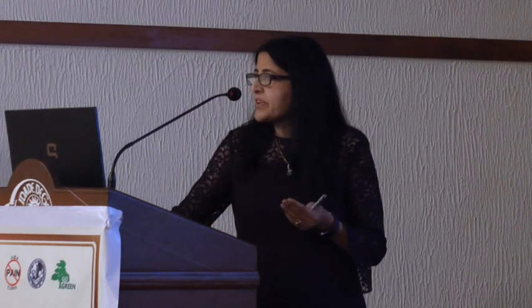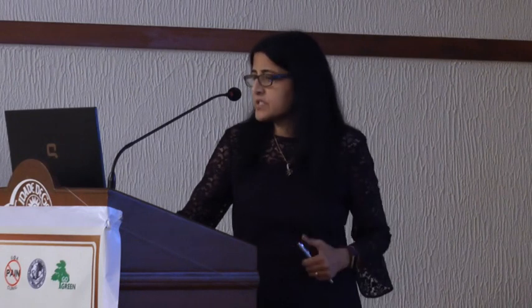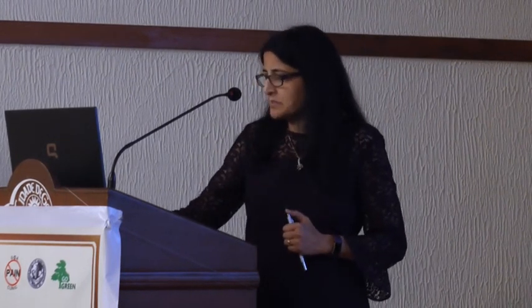So you place a high-frequency linear probe at the base of the posterior triangle, just behind the clavicle at the midpoint. A 100 millimeter Stimuplex needle is used. You can either use a lateral to medial orientation of your probe, or you can use anteroposterior approach. Again, when I demonstrate this scanning on the volunteer, I'll tell you exactly what I mean.